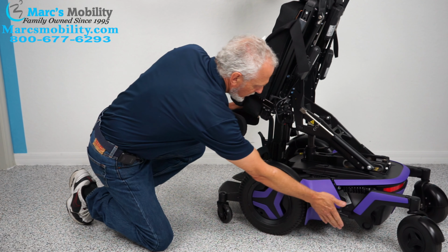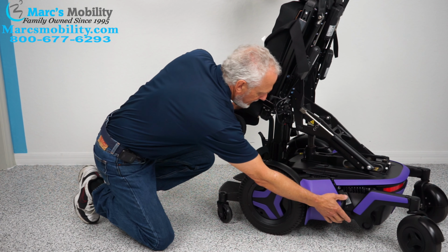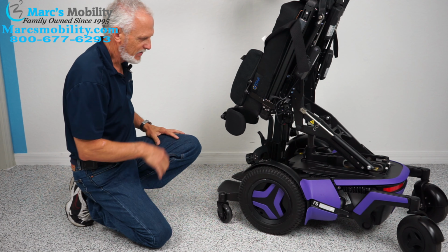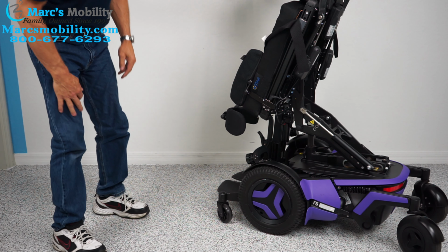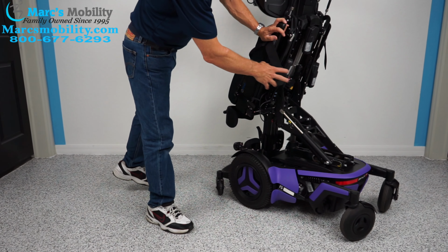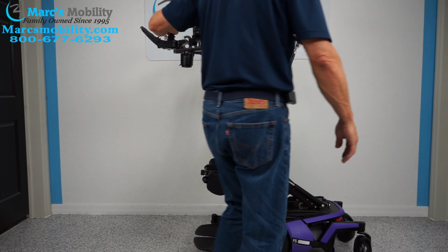So you have to do both motors, this side and the opposite side. Then you can roll the chair around. Put it back in gear. Turn your power back on. And now you're ready to go again. So you can see the way the chair is built. It's just built like a tank. So let's bring the chair back here.